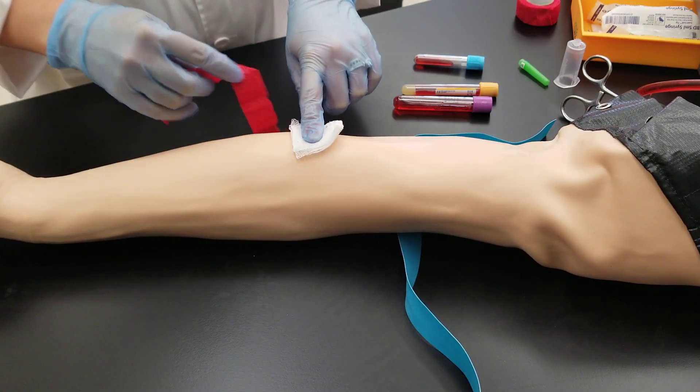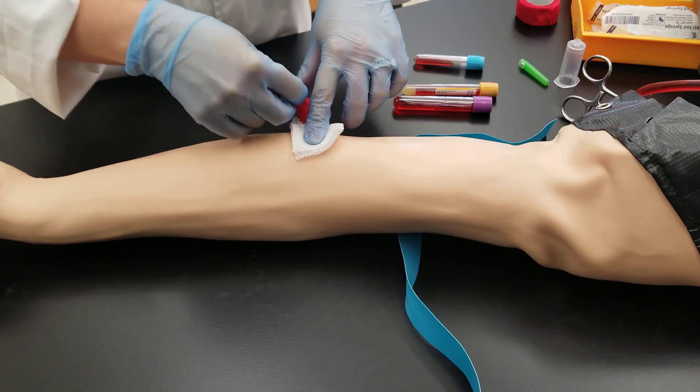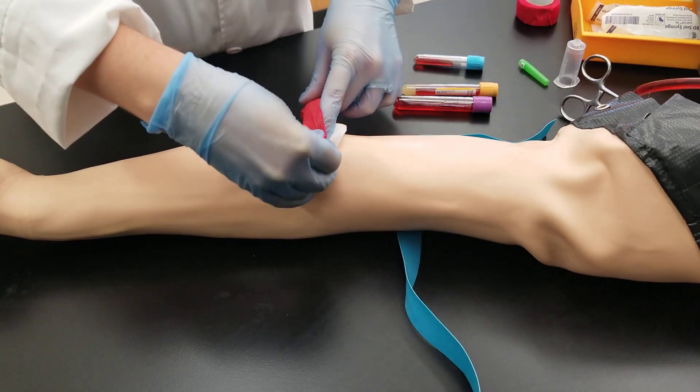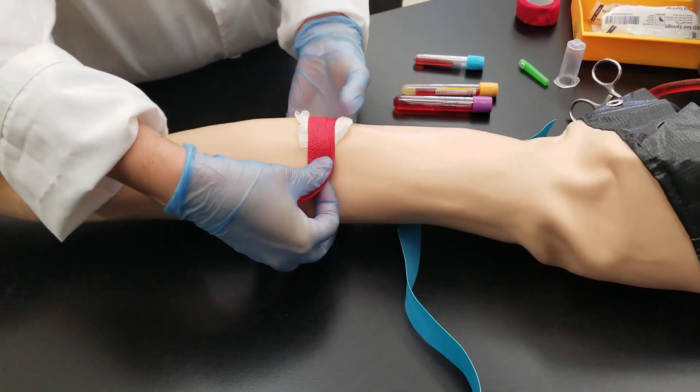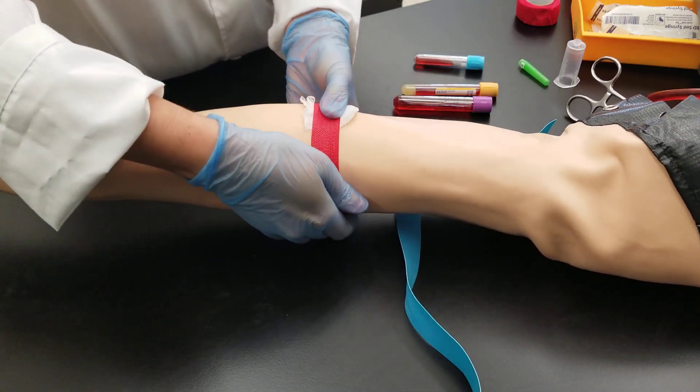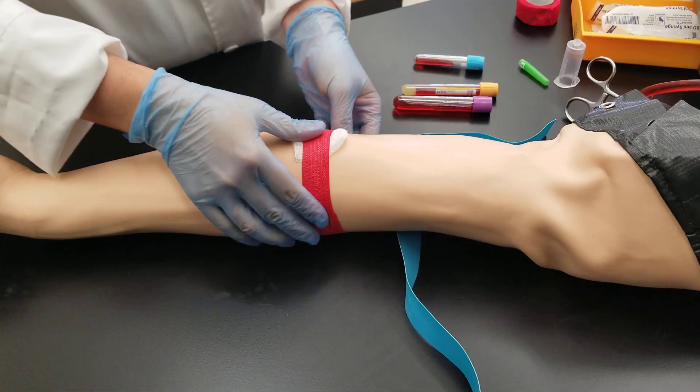You can ask the patient to hold this if you feel confident that they will actually hold it. And then you can go ahead and use the tape in order to secure the gauze.